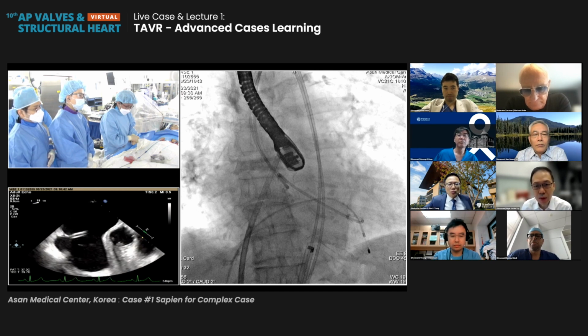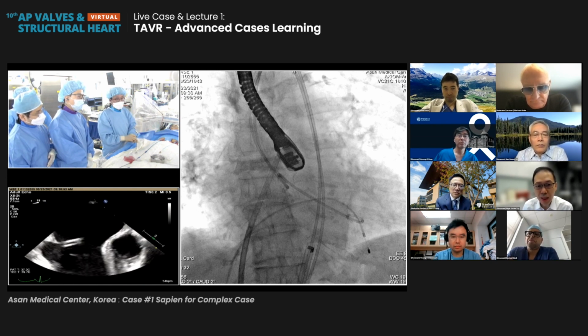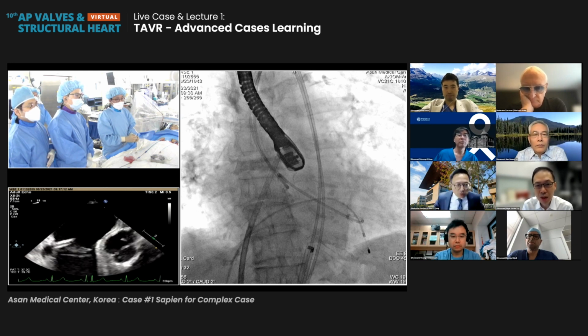So typically what we would do is the TAVR first, and give it some time for LV remodeling to occur. The LV pressure will drop over time. Afterwards, we may do a balloon occlusion and measure the LV pressures. In some patients, if the LV pressure remains very high, you may occasionally have to fenestrate the ASD so they don't feel so symptomatic. This is something we sometimes do in older patients.